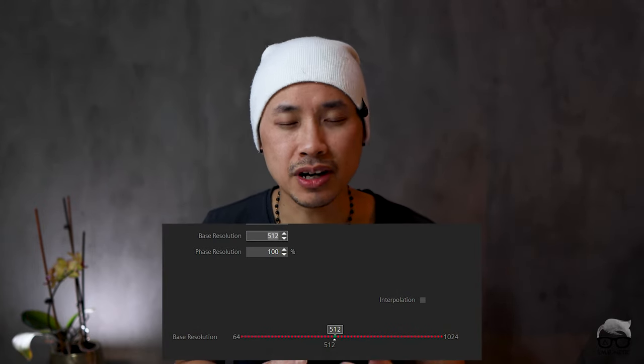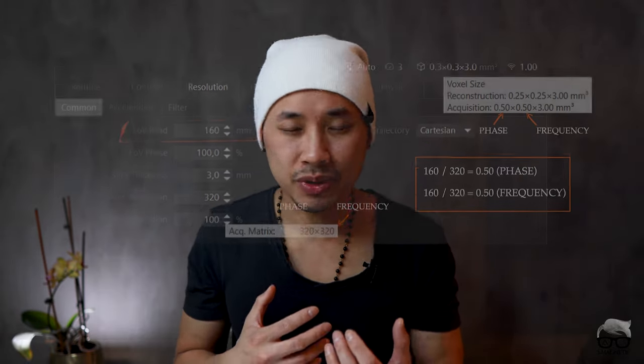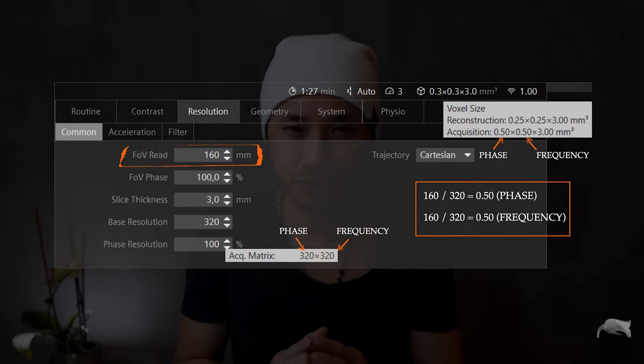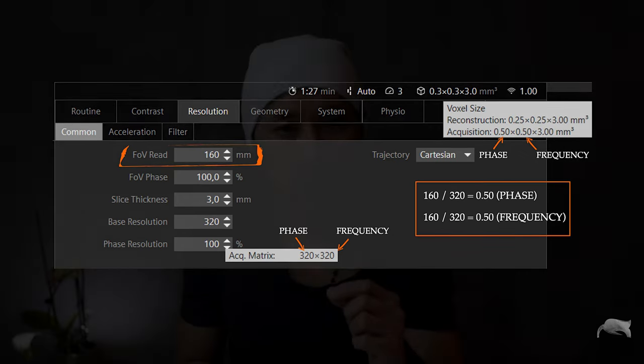Every now and then it's good to have a basic topic again. We're going to talk about matrix. Matrix alone doesn't mean much — you can talk about 500 or even higher nowadays. If we're talking about matrix we also usually mean resolution, but having a high matrix doesn't automatically mean high resolution. You need to also take into account the field of view. Field of view divided by the matrix gives you the pixel size, and that's the resolution. I'm going to show you this on a scan today.